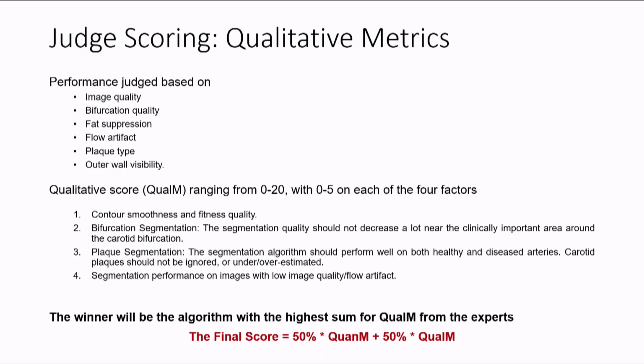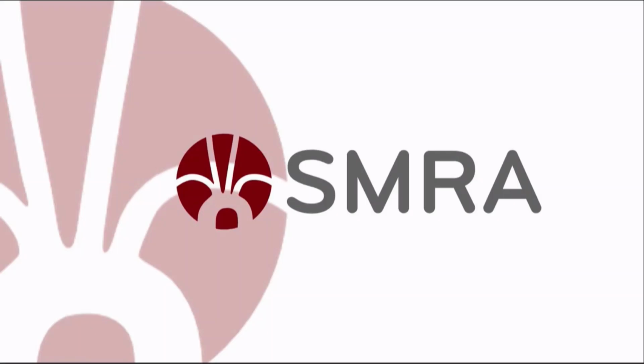So all the participants were evaluated on 4 metrics: contour smoothness and fitness quality, the segmentation near the bifurcation, and also when there was real plaque instead of just a normal wall. And finally, whether there was good performance when there was low image quality or artifacts.